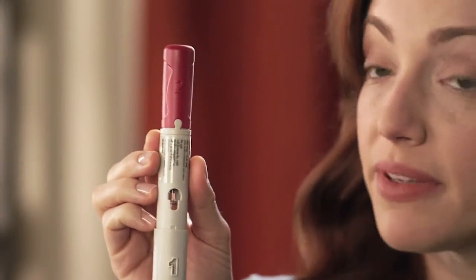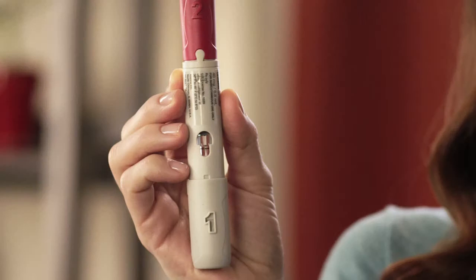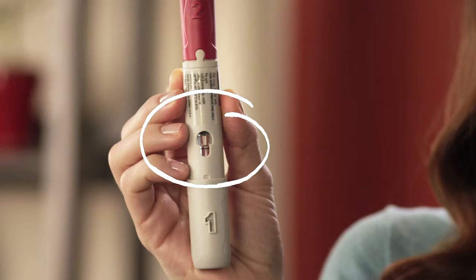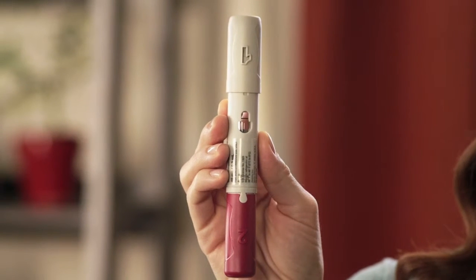There's a gray cap, number 1, and a plum-colored cap, number 2. Holding the pen with the gray cap pointing down, I make sure the liquid inside the window is up to or close to the fill line. Then, I turn it over so that the gray cap is pointing up to check that the liquid is clear and colorless. It's okay to see a few bubbles. But if you don't see the full amount of liquid, or if the liquid is cloudy, discolored, or has flakes or particles in it, don't use it and call your pharmacist.